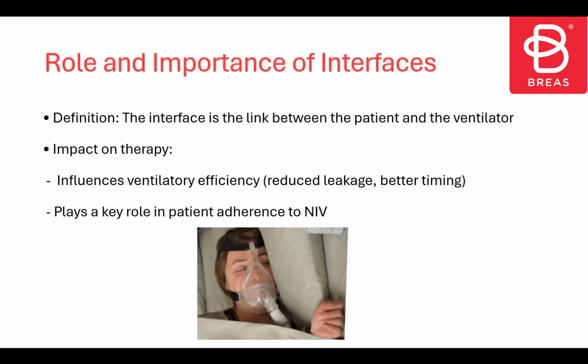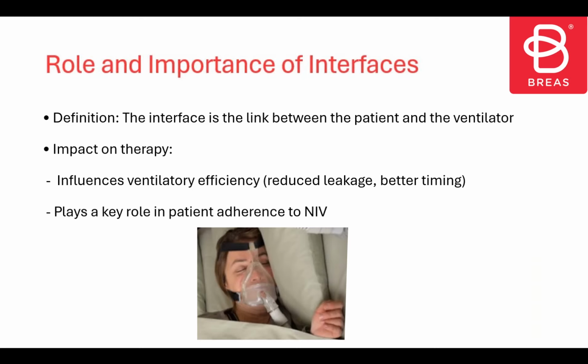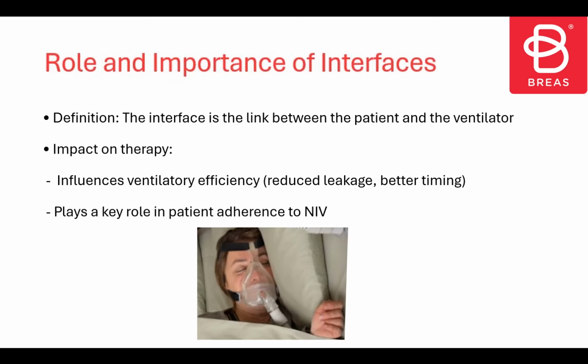Interface is the link between the patient and the ventilator. There is a direct impact on therapy. There is an influence on the effectiveness of ventilation and especially on adherence to ventilation therapy, and that's why it's important to choose the right mask.